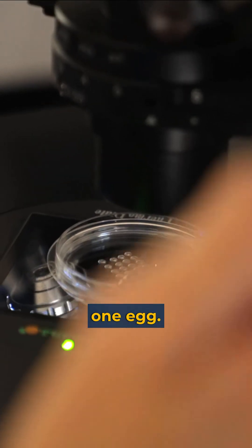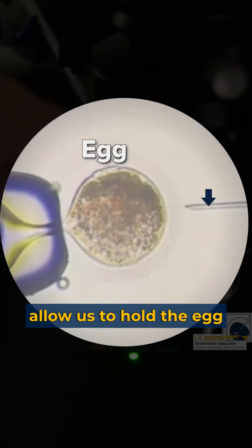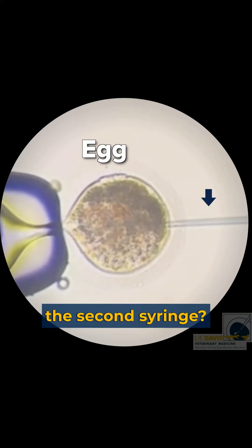In each of those droplets there will be one egg, and in that long one there will be the semen. This allows us to hold the egg and then inject the sperm with the second syringe.